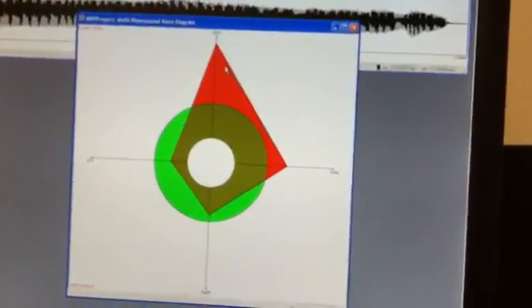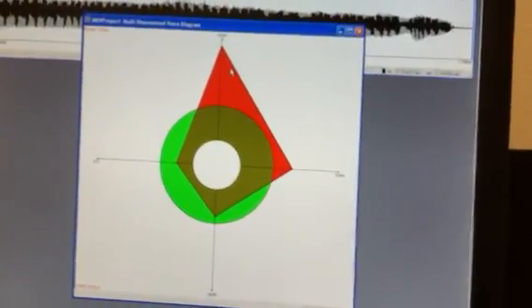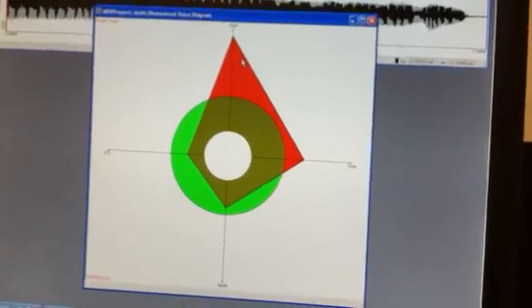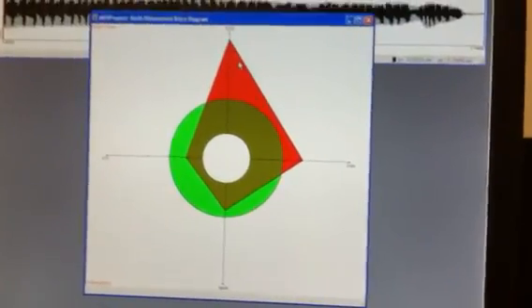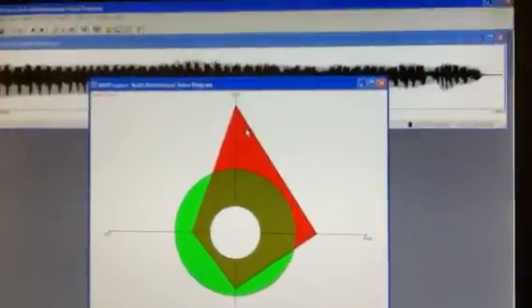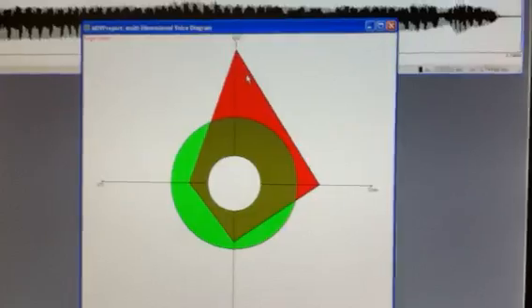Here I have an abnormal rap which is in red and an abnormal shimmer. Press F8 on the keyboard and that gives you your statistics.